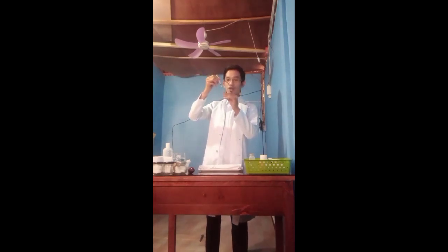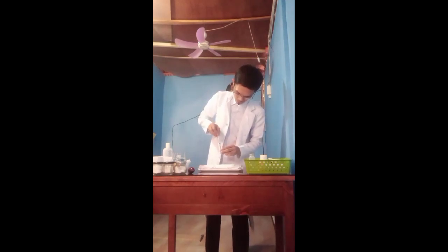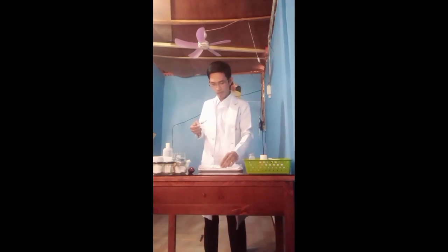So now I'm going to aspirate it now. Okay, over here. Ready?